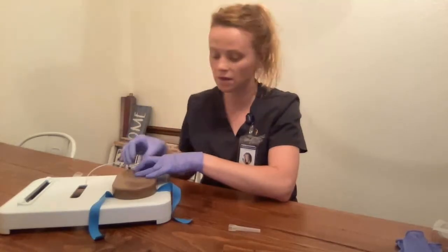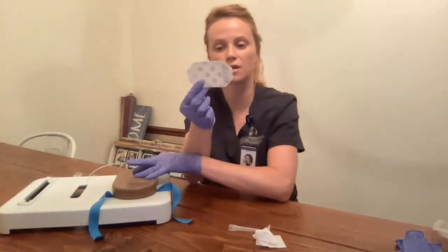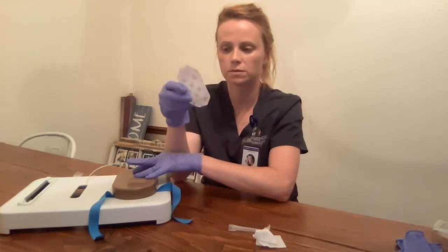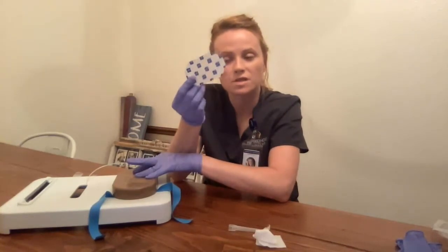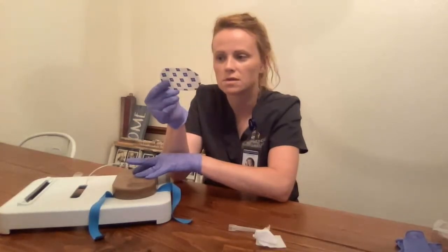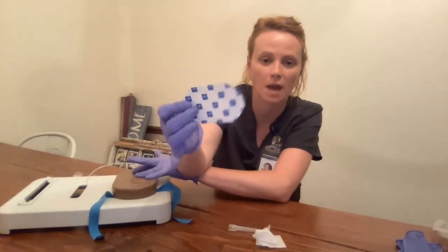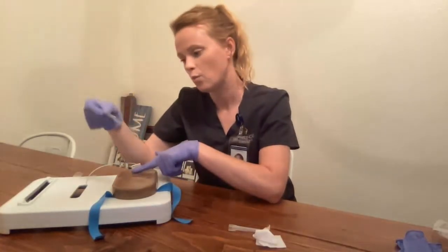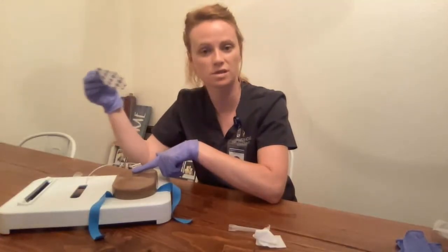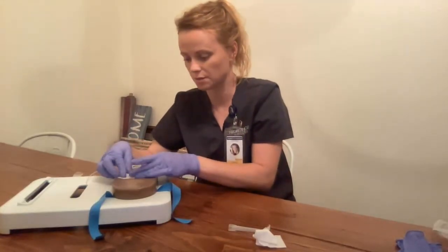While stabilizing the IV here, I want to apply my sterile dressing. Another item I can't fully use properly is the sterile dressing — I don't want to take the backing off because I only have one. Once you use it, it is no longer usable. So in the real world, I would take off this backing and put it over the site. When applying the sterile dressing, I want to make sure I don't put it on any part of the extension tubing just in case it needs to be replaced. I'm going to place it right over here, just up against the extension tubing part.